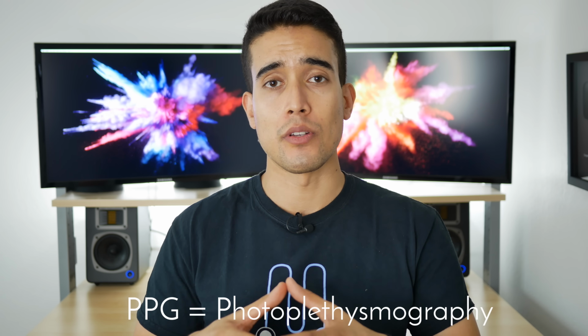It's important to note, however, that the ECG function only works when you have your finger touching the crown and you actually ask the Apple Watch to do an ECG. It can actually prompt you as well. Using the optical sensors on the back of the watch, it uses PPG to detect your heart rate. This is a technology that we've seen in the other Apple Watches and various fitness trackers and other smartwatches. If the Apple Watch detects an irregular heart rate, it will prompt you to perform an ECG.